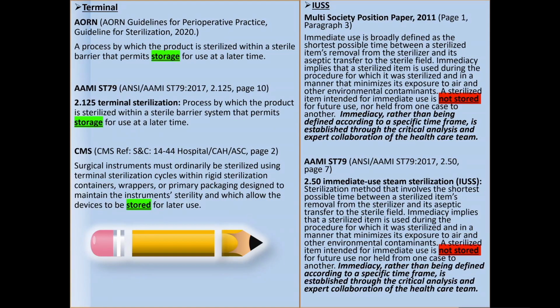Now, that is very important when you come to one tray. There is a host of confusion out there because in the 510K for one tray, it included performance testing with shelf life of 2 days or 48 hours. This is a fact. Remember, the title of this presentation is Know the Facts. I'm all about facts. And so the FDA has certainly acknowledged that one tray has storage of 48 hours as far back as the 510K.